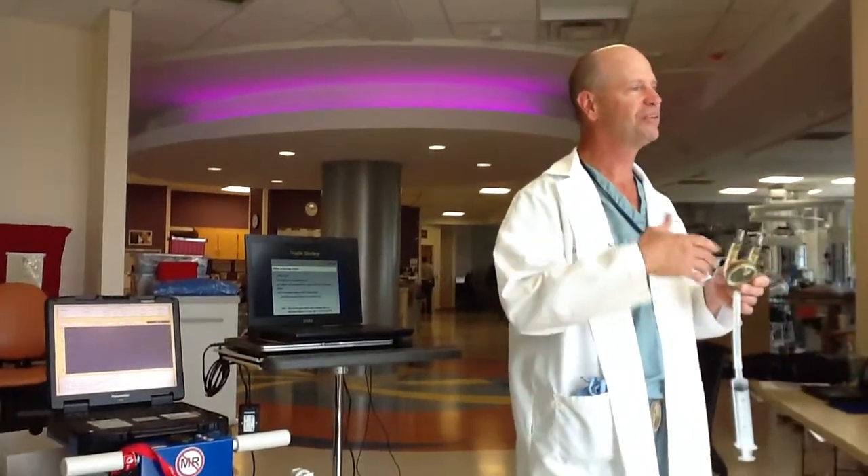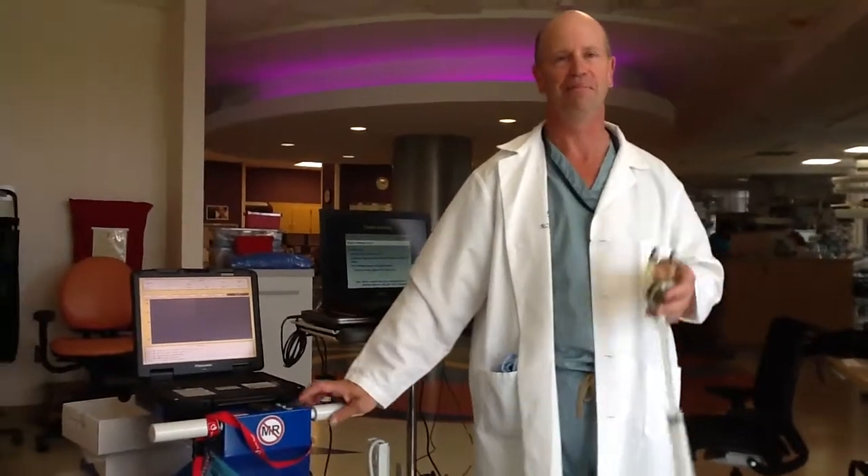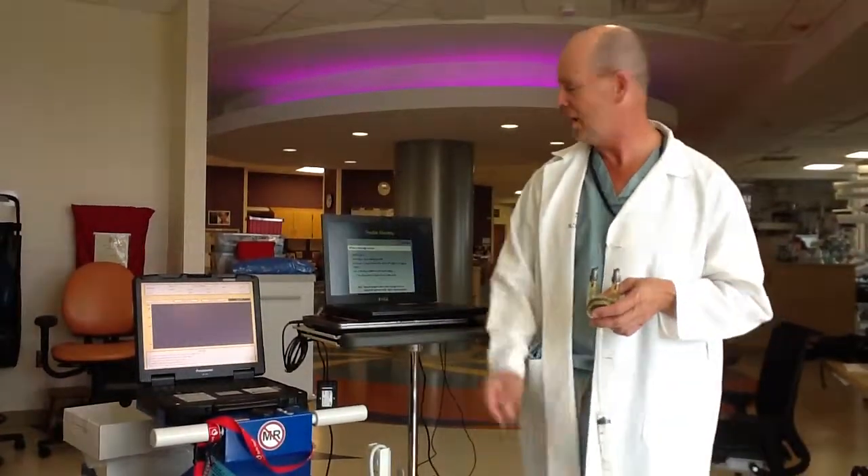Moral of that story: when you have an alarm, check the pump and the patient first, because it may not even be this device — it might be the bed or something else.